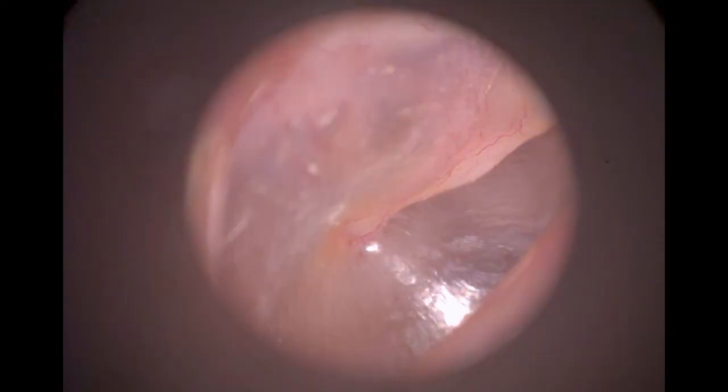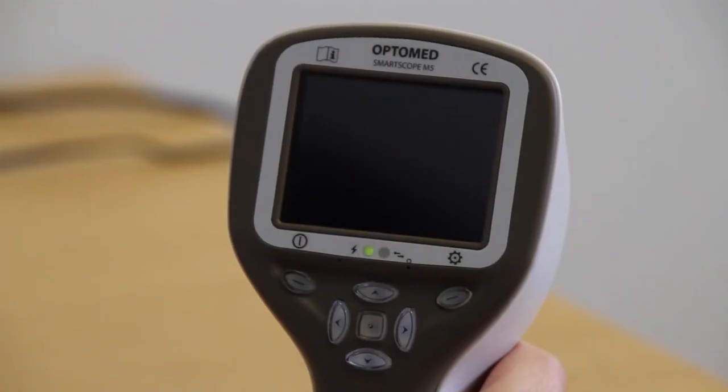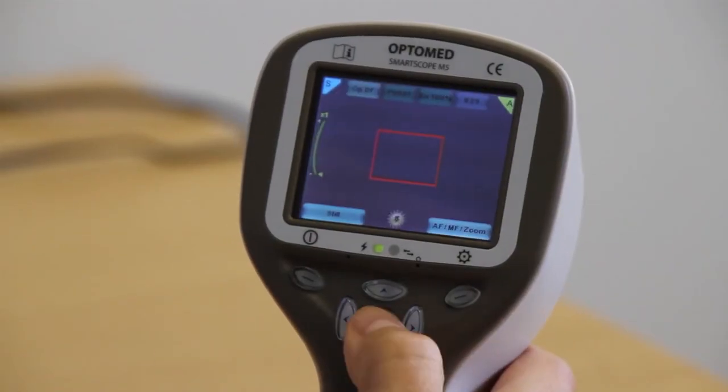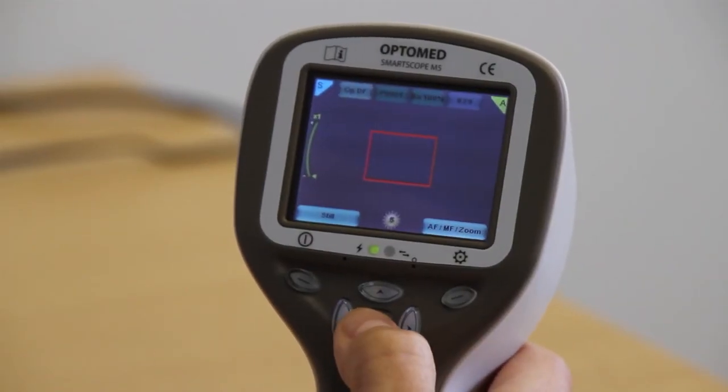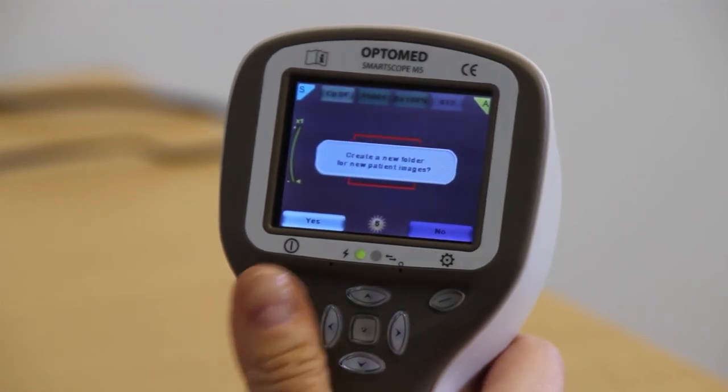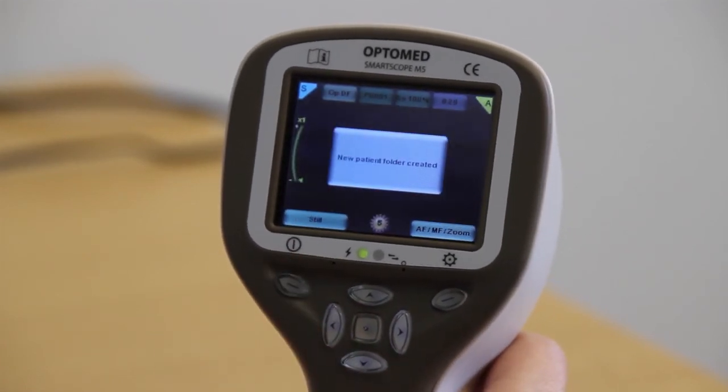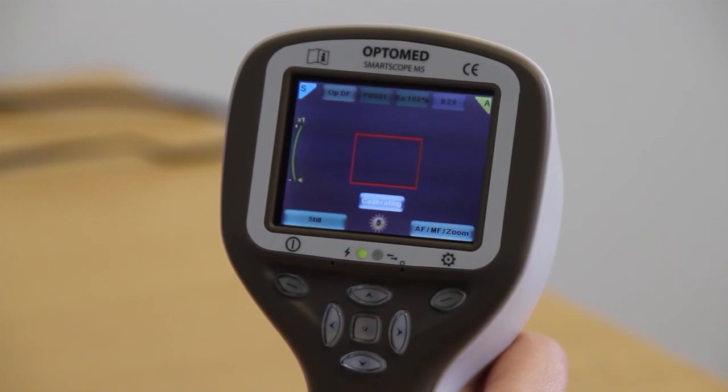In order to ensure good quality of examination, take multiple images. If multiple patients are examined during one session, create a new file folder for each patient by pressing and holding the middle key.